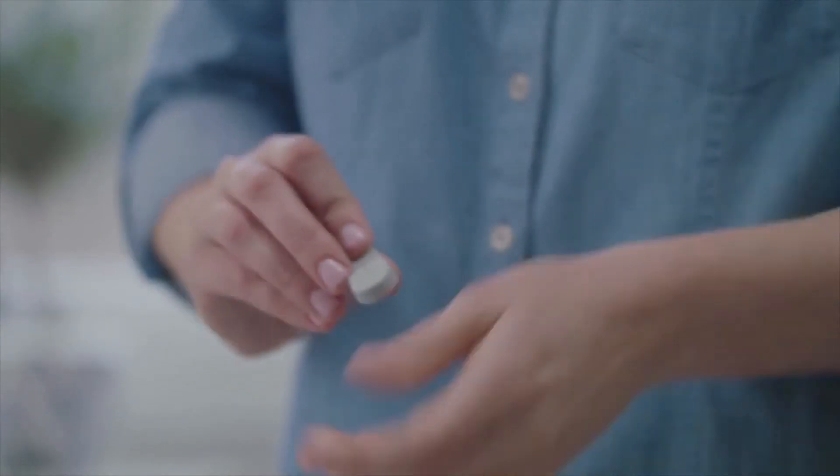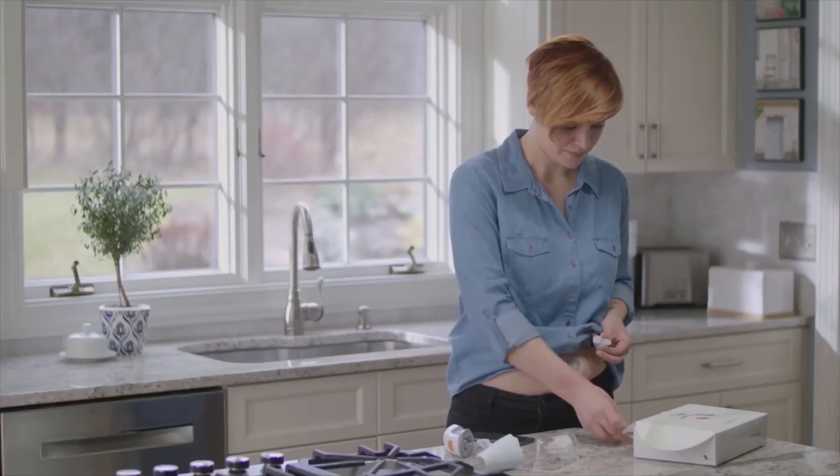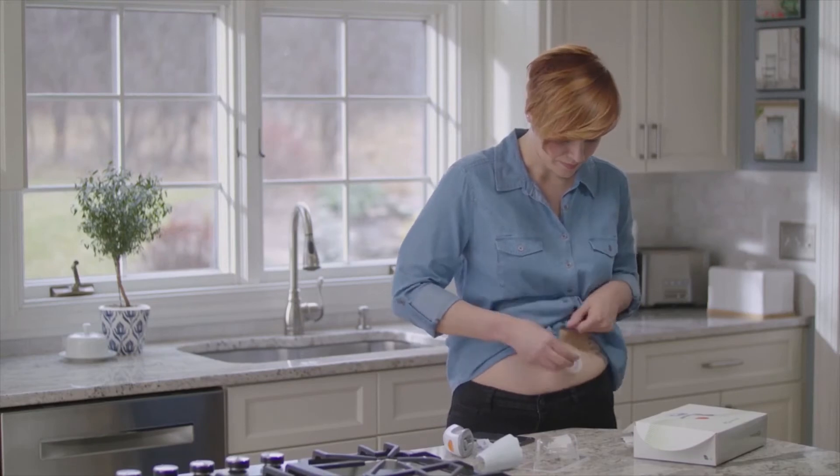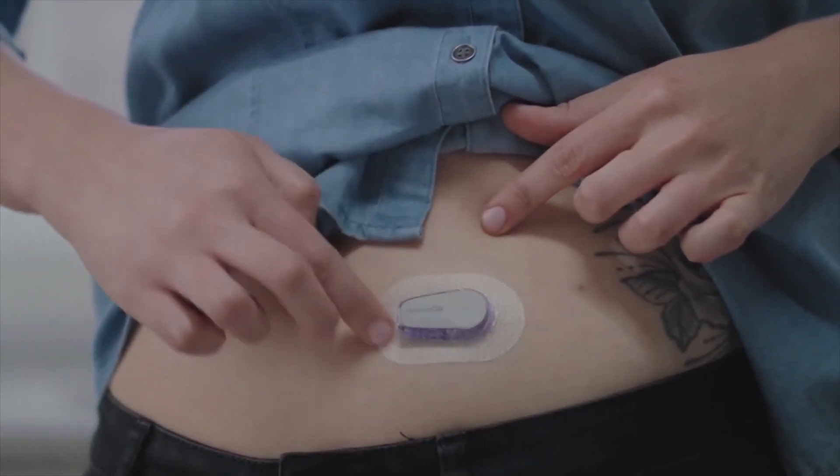You've successfully inserted your sensor. Now it's time to attach your transmitter. Clean your transmitter with an alcohol wipe and let it dry. Insert the transmitter tab into the slot. Snap the transmitter firmly into place. Then rub around the patch three times.